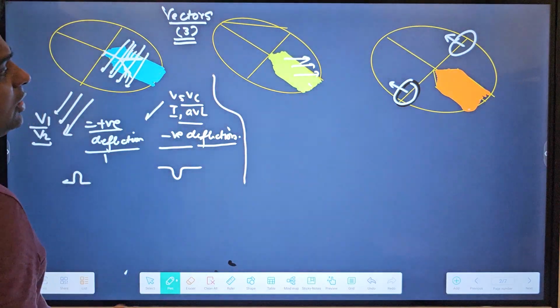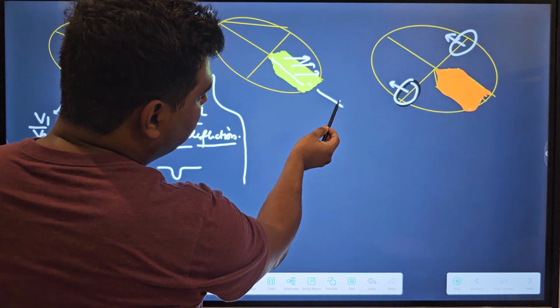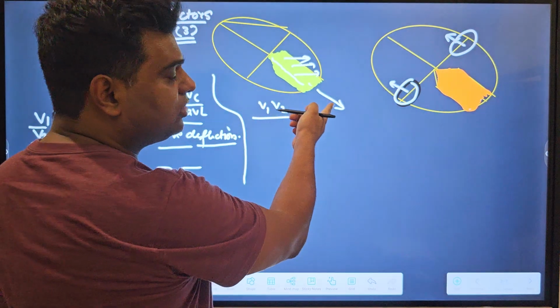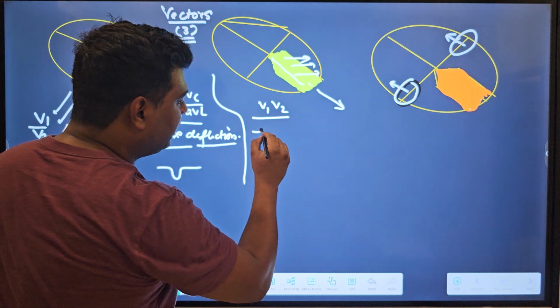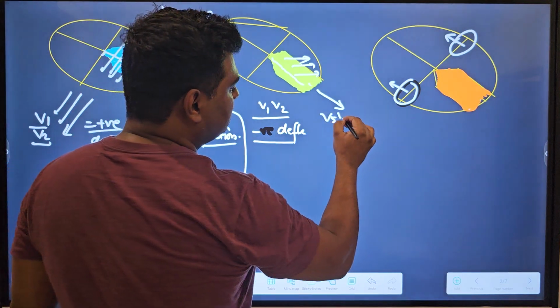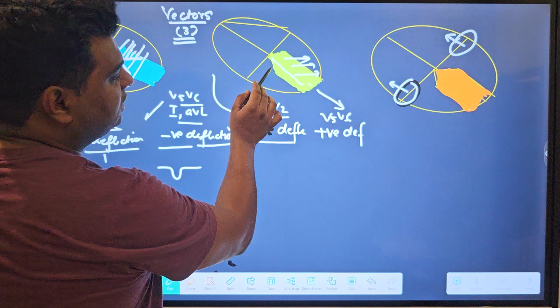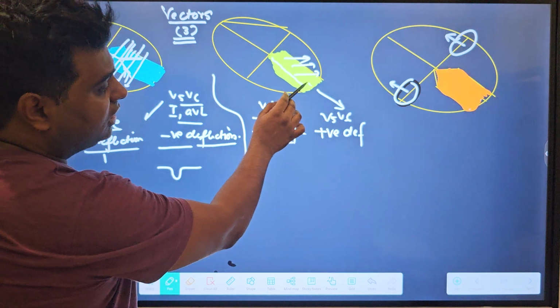Now coming to this. Septal depolarization and ventricle depolarization will have a net vector in this direction. So now if we talk of V1 and V2, V1, V2 will record a negative deflection because V1, V2 are here. So for them, this is going away from them. So they will record a negative deflection. And V5, V6, for them it is coming like this towards them. So they will record a positive deflection. I am again explaining this, that with septal depolarization and ventricle depolarization, the net direction is like this, that is inferior laterally.